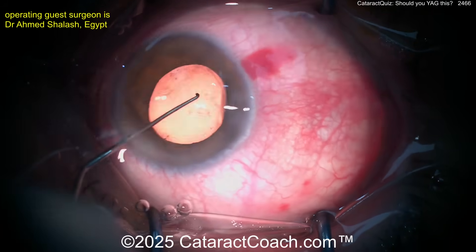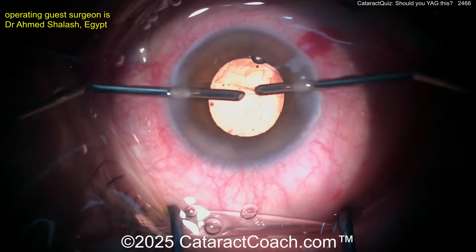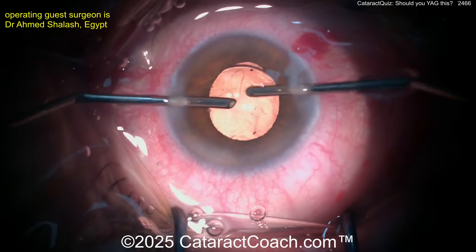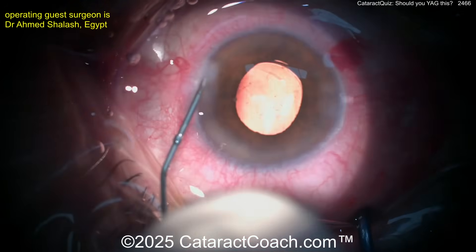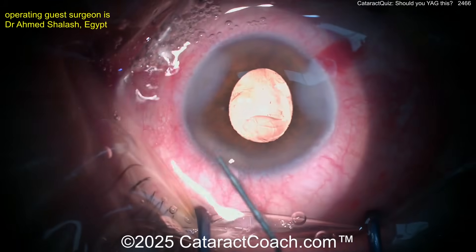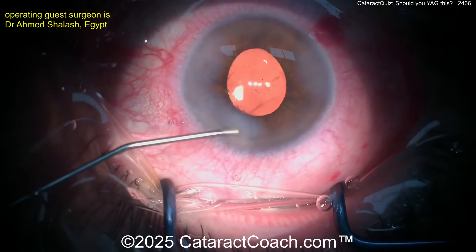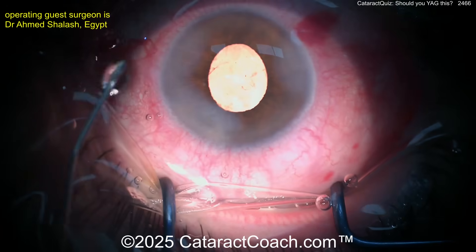What a beautiful outcome here. The capsular bag didn't fibrose much — you just had a lot of proliferation of those lens epithelial cells causing a lot of material. If you had done a YAG laser, gosh, all that stuff would be floating in the vitreous cavity, probably even inducing inflammation, and the patient would need to be on topical steroids for quite a while.